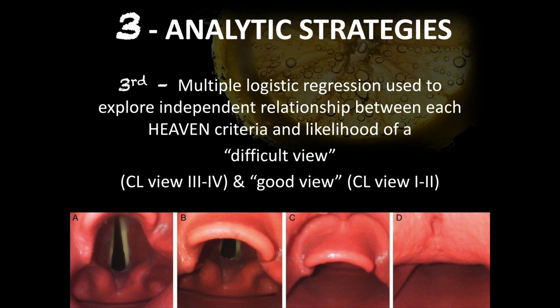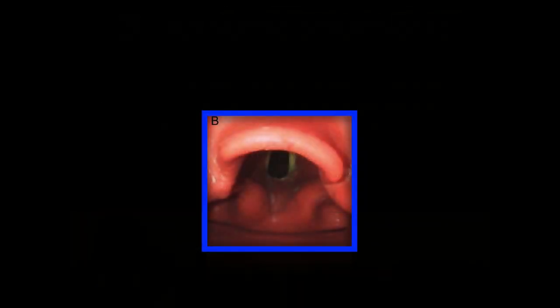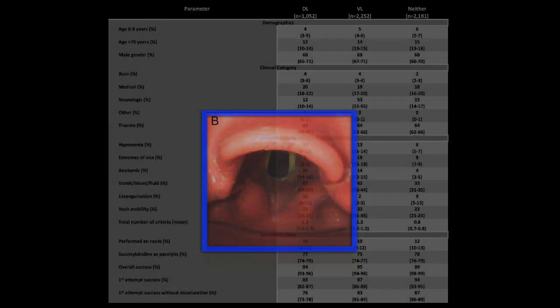With a video laryngoscope, you want to just gently enter into the mouth, midline, right? We're not sweeping, we're just going straight down the midline and slowly lifting. And a little goes a long way. And so really what we're looking for is this view right here. That is the most optimal view with a video laryngoscope, the VL view.